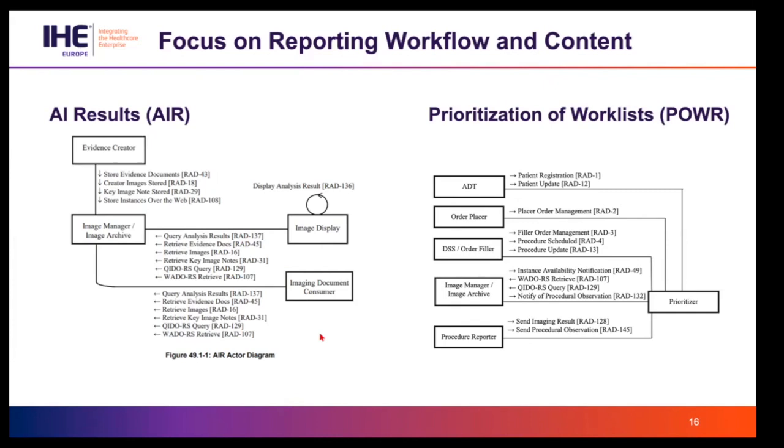Again, those profiles have been around for 2-3 years, well established, and we very much encourage everyone to look at the ability to test these profiles at Connectathon so they could be advanced to final text. As you would see, there are a lot of transactions and AI results profiles that allow exchanging the AI results in different formats and different encodings. Next slide.